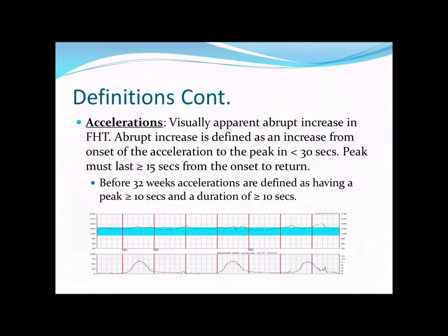Okay, so accelerations. The definition is basically an abrupt increase, where we want the acceleration to peak in less than 30 seconds. But the whole acceleration has to last at least 15 seconds. And if you're before 32 weeks, we only say that they have to last 10 seconds.